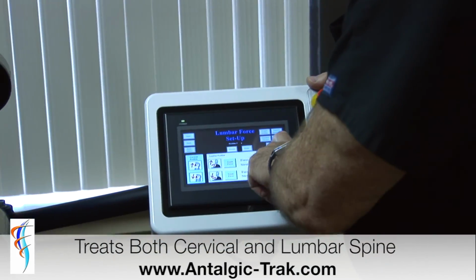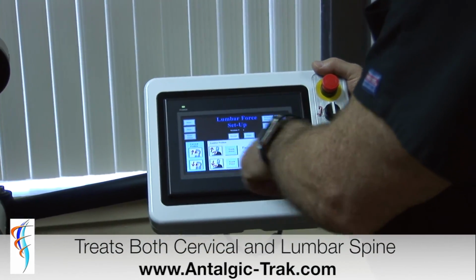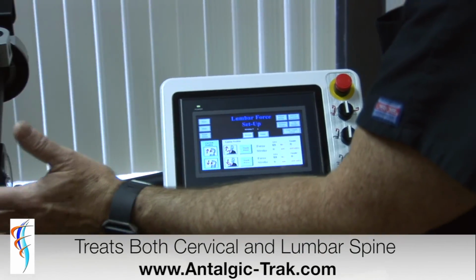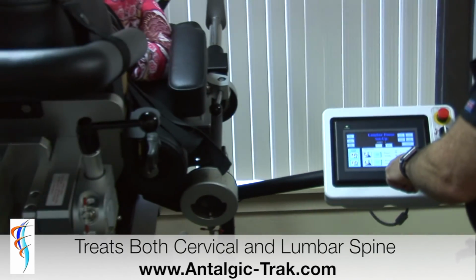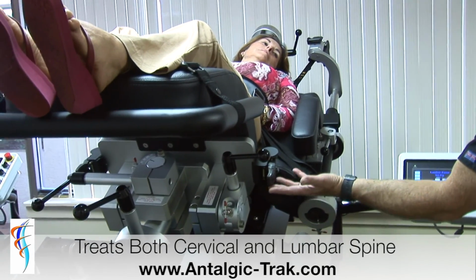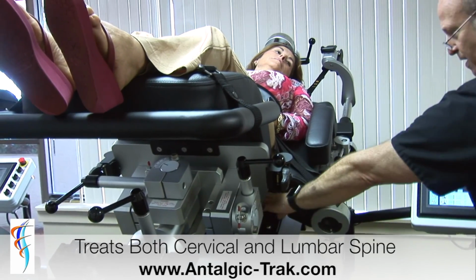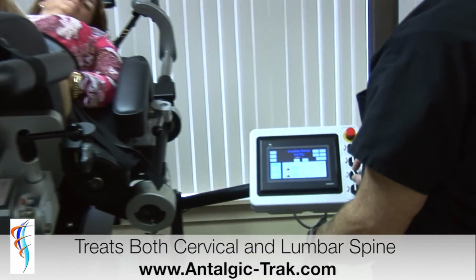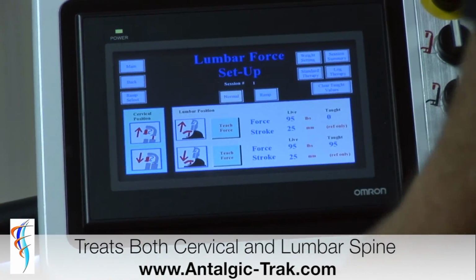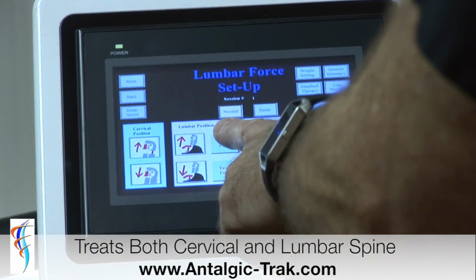and so I'm going to clear out my last session, and now I'm ready to just distract the seat downward, and we can see the poundage starts to come up. As we distract, I'm going to translate the seat a little bit forward to raise the pelvis off the seat back. I'm going to teach this poundage force. I'm going to release the poundage. I'm going to teach it.